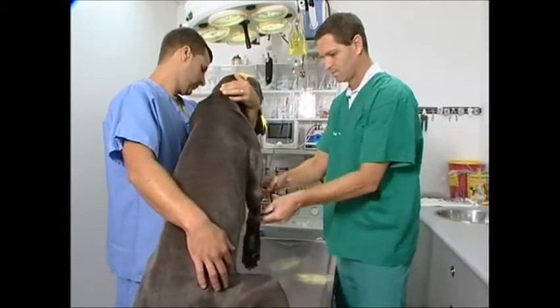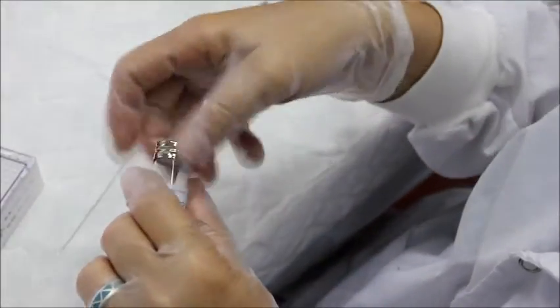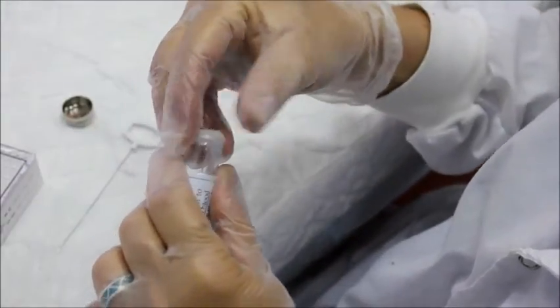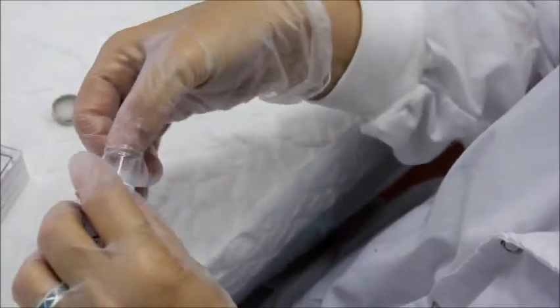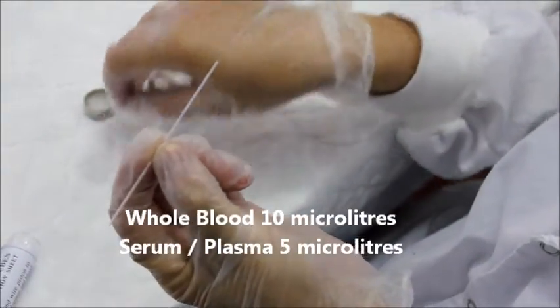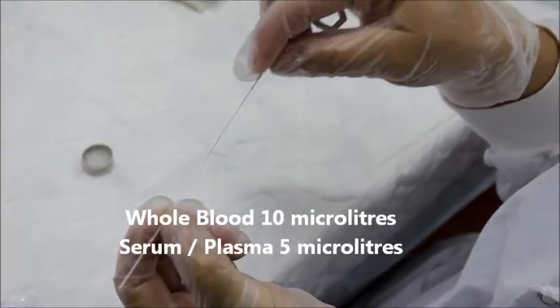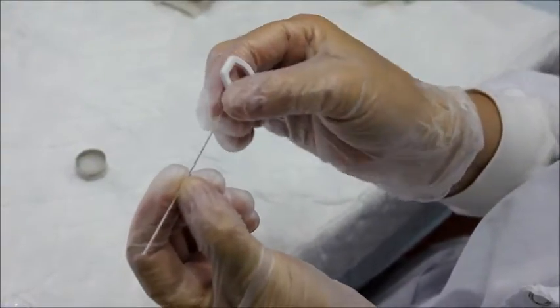Take a sample of blood from your pet being tested. Use a pipette or capillary tube to draw blood or serum from your test sample. For the testing of whole blood use 10 microliters. For the testing of serum or plasma use 5 microliters.